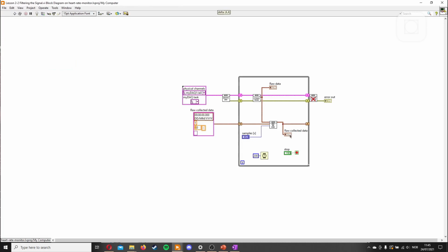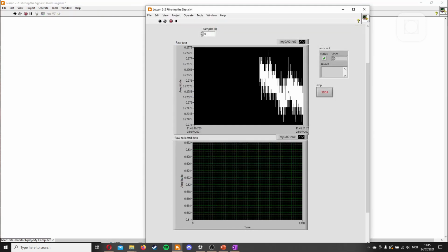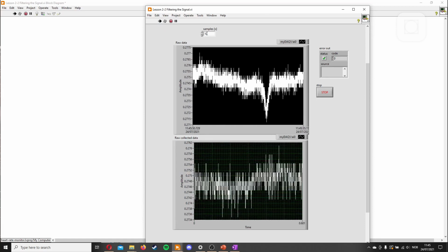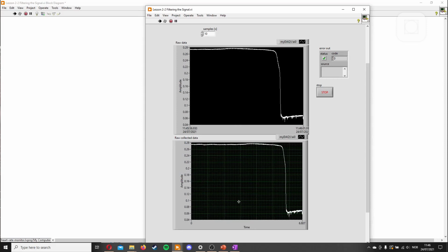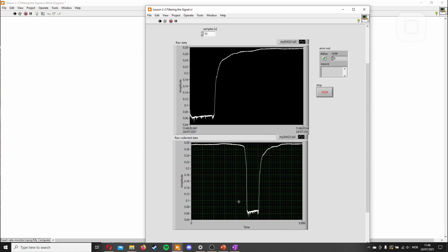What we want now is to filter this raw data so we don't get noise. If you see now, we will have a lot of these jagged edges. Oh, we have to set from last time. With all of these jagged edges, we see this noise. I'm not doing really anything. Now I'm covering it. But all around, we see this noise, and this is what we want to remove.